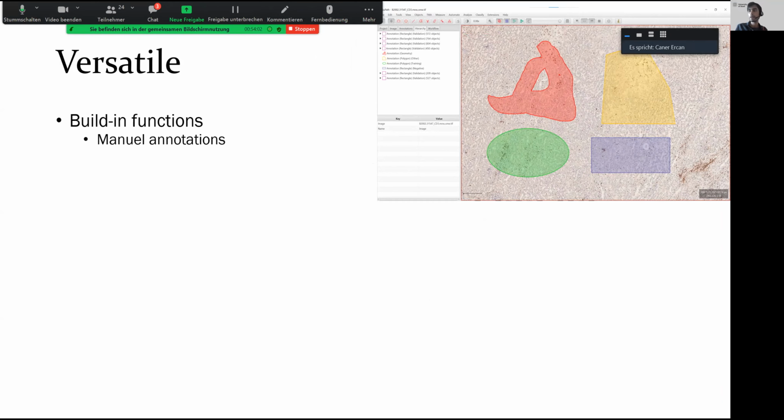To be honest, my personal experience until this moment is that QuPath has always been the most convenient software for me for making annotations. Whenever I needed to do any other tasks in any other software or platform, I could carry those annotations over there, or I could export the data related to these annotation regions. And those annotations can be of different types. It's very functional. It gives a good variety of options.